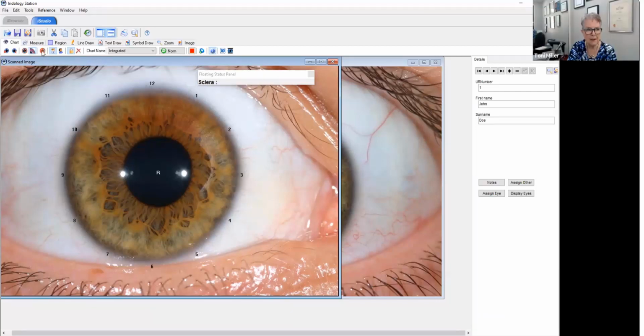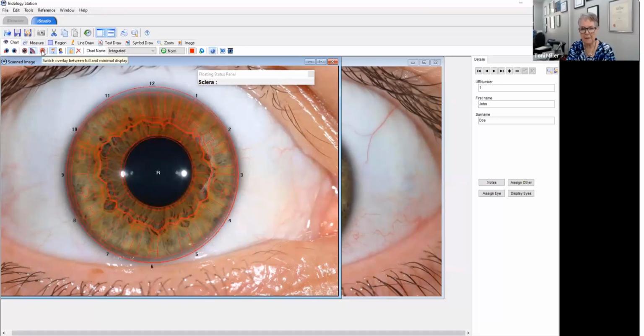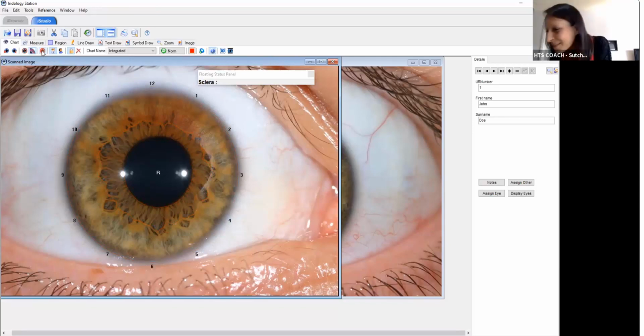Just by using this button here. So just took it back off, but it still leaves the time on there. Yeah, brilliant. That lets me know that I've got a chart on there. Oh, look. Oh, my goodness. I just did that and it left my collarette in there. Brilliant. So to save it. Duodenum. I knew I had a problem there. I knew that was my issue.